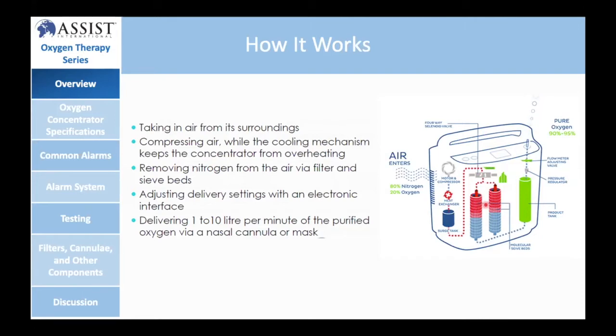So when compressed air, high pressure, mixed air passes through this zeolite material, the zeolite material adsorbs nitrogen and allows oxygen to pass through. Okay, so on the bottom side you have purified oxygen coming out.